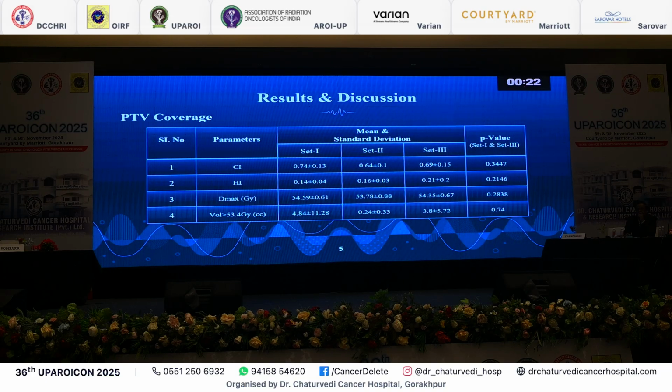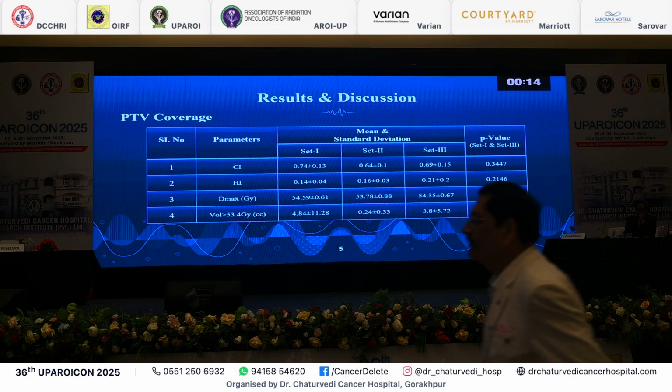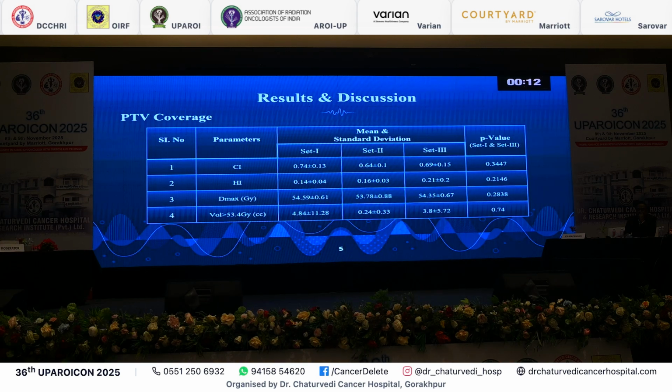So the plans of set 1 and set 3, that is Millennium and HDMLC, were compared for the p-value, and the results are tabulated here. The set 2 is directly convertible plans. Only a few samples we could get, so only mean and standard deviation for the set 2 plan is tabulated here.